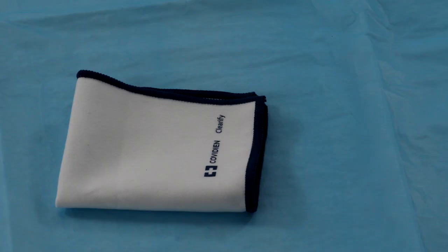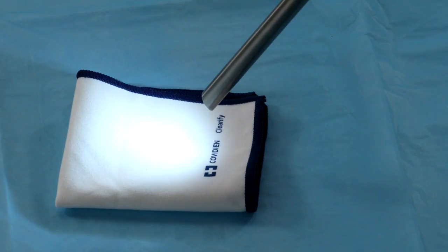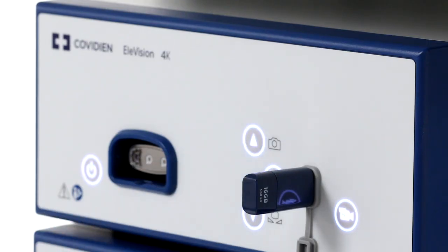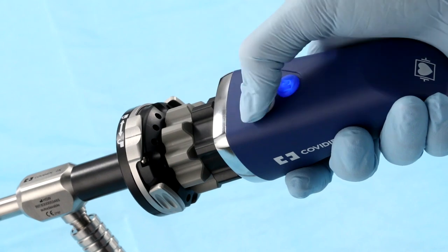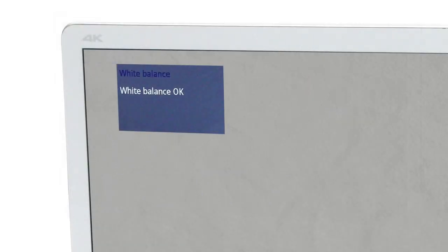To set your white balance, start by directing the laparoscope at a white object approximately 5 cm away. Your white object can be a piece of paper, linens, or any other objects that are solid white in color. Next, press the white balance button on the front of the CCU or the white balance button on the camera head. Once your white balance has been set, the message 'white balance OK' will display on your monitor, allowing you to move on to the next step.